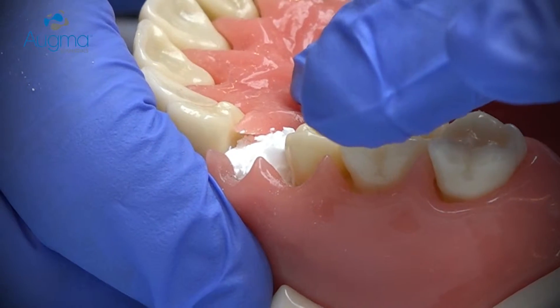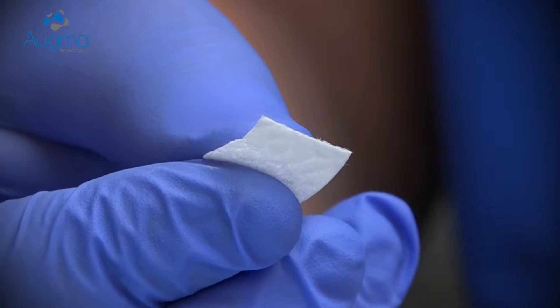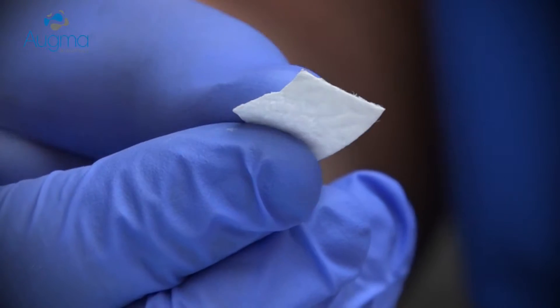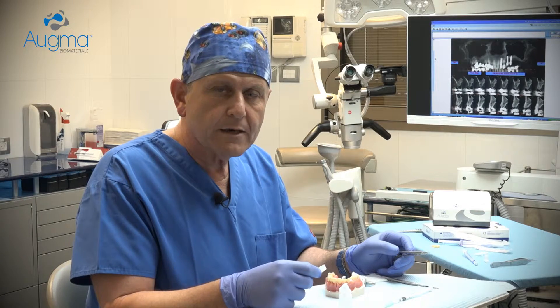You cannot leave the material exposed to the oral environment — you must protect it with something. For that purpose, you can use a simple collagen sponge or a membrane, up to your preference. The collagen sponge is intended to protect the graft from masticatory forces and it is sutured together with the soft tissues around it.